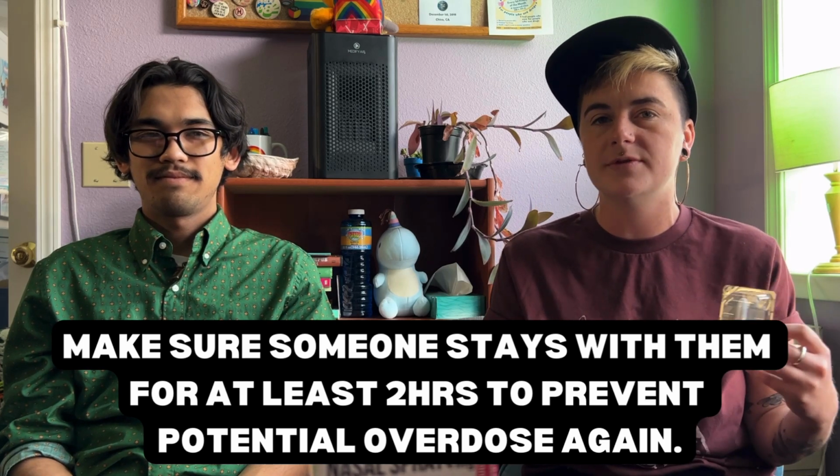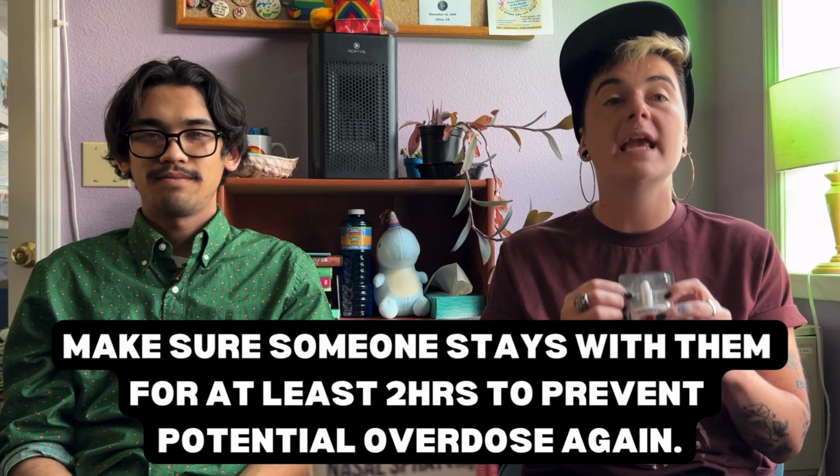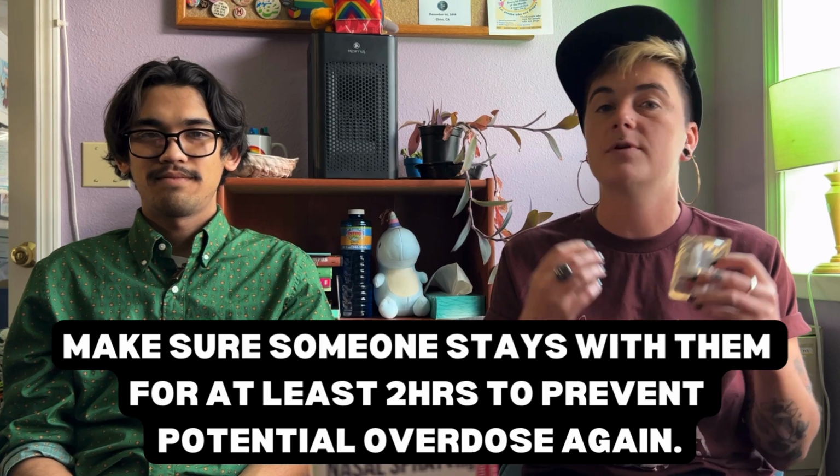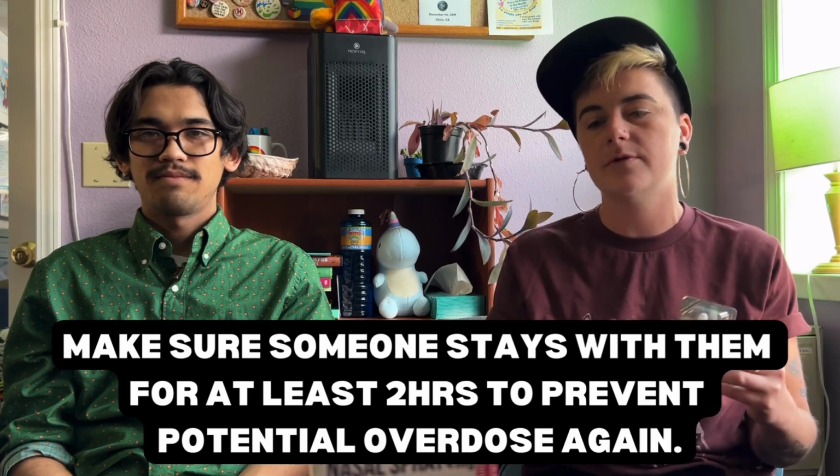Another option throughout this process is, while you're waiting in those 2 minutes, you can administer rescue breathing if you're safe and comfortable with that person, to help get oxygen flowing through their body again.